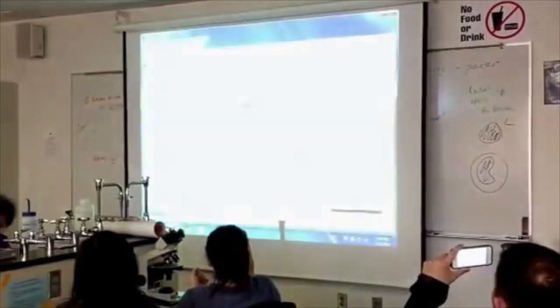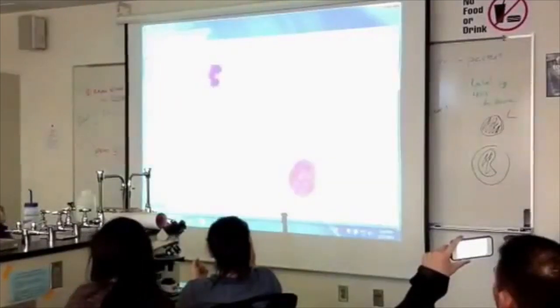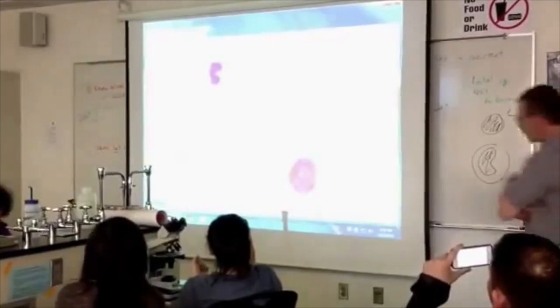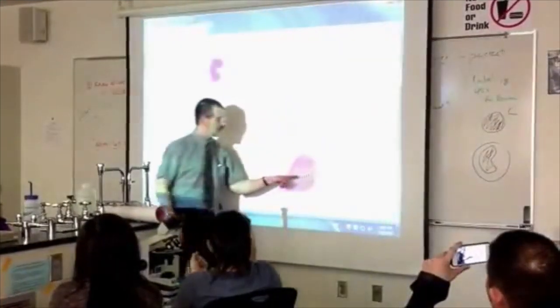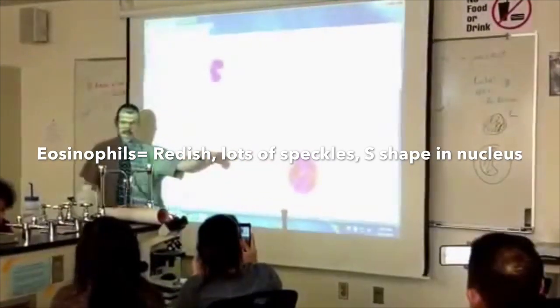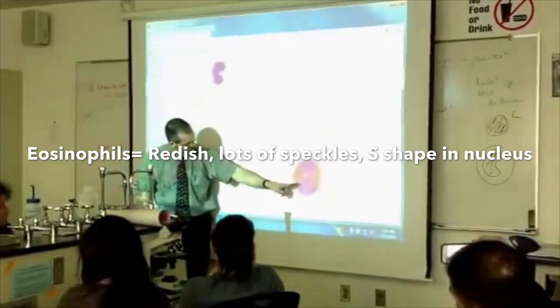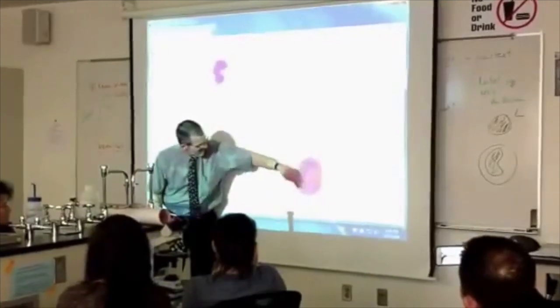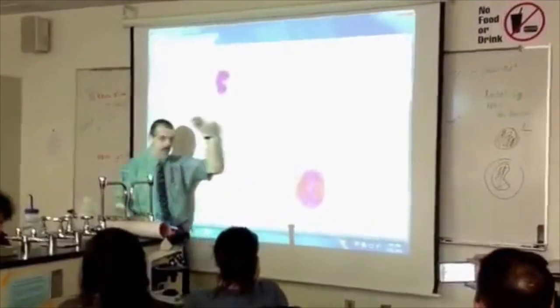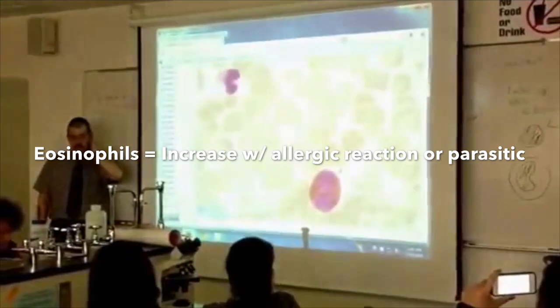traditionally. Let's talk about speckles. Let's find a speckle you want. Anyone find a granulocyte for me on this picture? Right here. This is an eosinophil. It's going to be granular, lots of speckles all over. Normally these are reddish, not always, so don't always say the red one. Normally they are. And if you look at the nucleus, it has this weird sort of figure S, bilobed, kind of ampersand shape. But it's going to be speckled enough that you'll notice it. You'll see the dots. Okay.